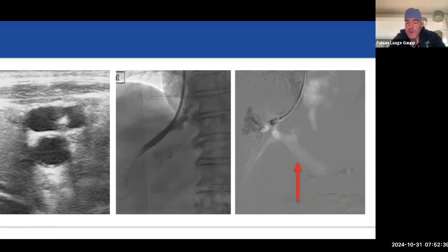And as you said, even better, of course, is if you have intravascular ultrasound guidance, because then you can have live guidance. But in order to do that, you need to get into sheaths, and of course, you also need the intravascular ultrasound, which is quite expensive sometimes. So many people prefer to do it the old school way, just with a CO2 portogram, and then using that as a target.